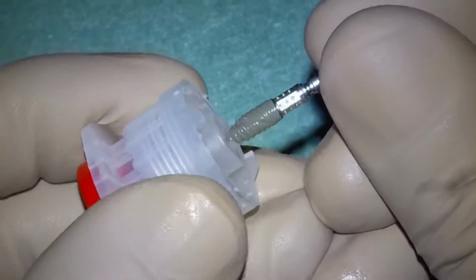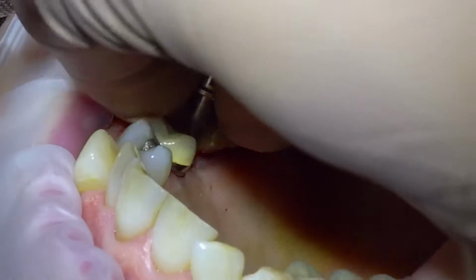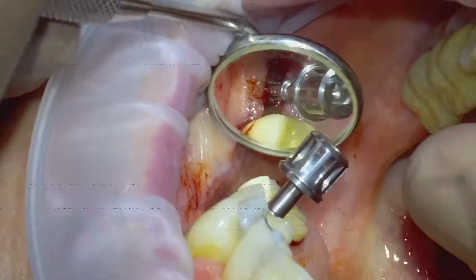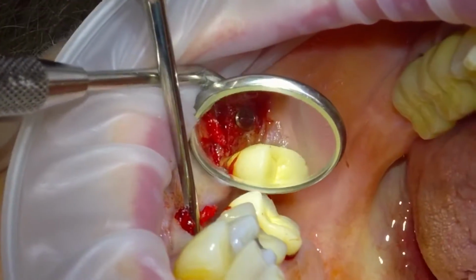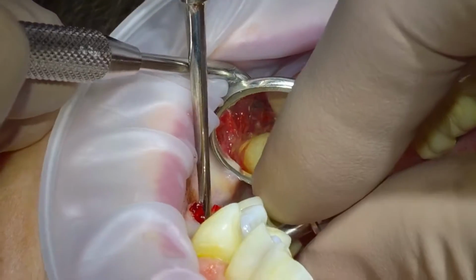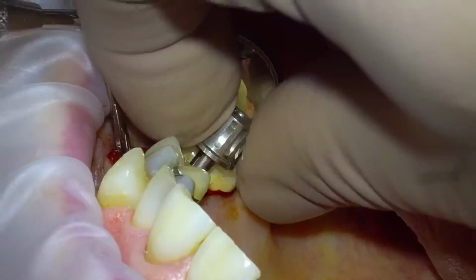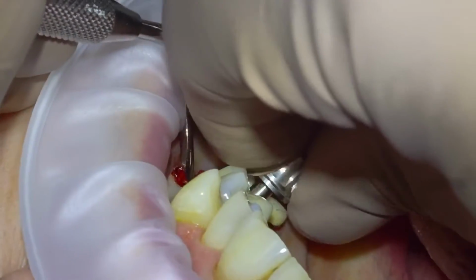This is our implant in the carrier, and then we just hand place the fixture into place, into depth, and you see it's just type 4 bone. Take the carrier off, check that it's in a good position, and then if we need to, just a couple more turns to make it just like 1.5 mm subcrestal.